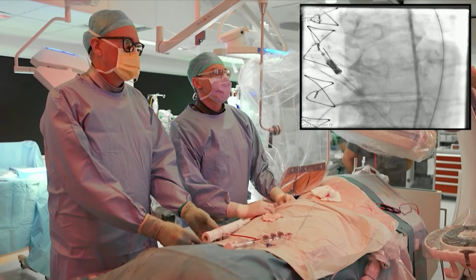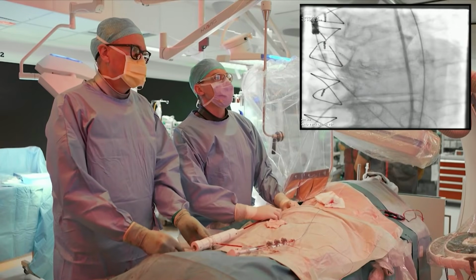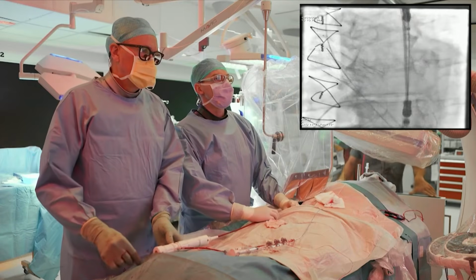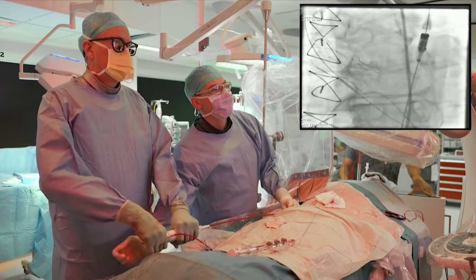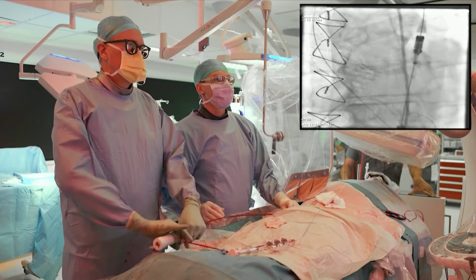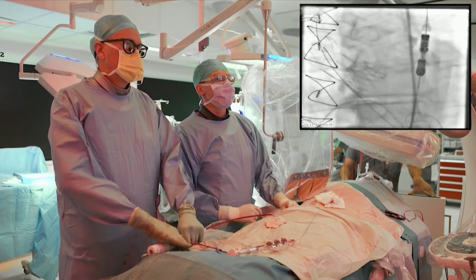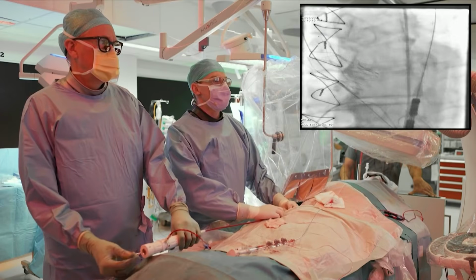It's probably visually a little bit easier to see the alignment in the cusp overlap view, whereas we typically do the implant in the 3-cusp view, so we prefer to stay in that. But it depends a little bit on how experienced you are using cusp overlap view, but also whether you can do it. Sometimes you have extreme angles, so it's a little bit difficult to actually achieve a good cusp overlap view.